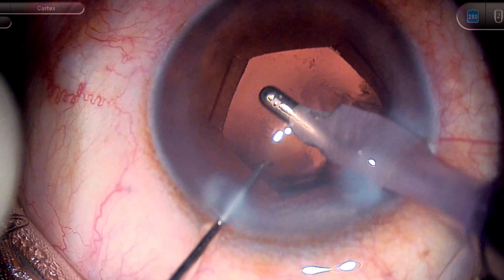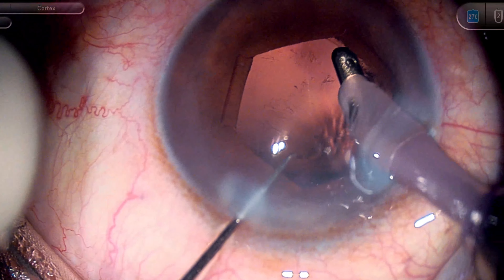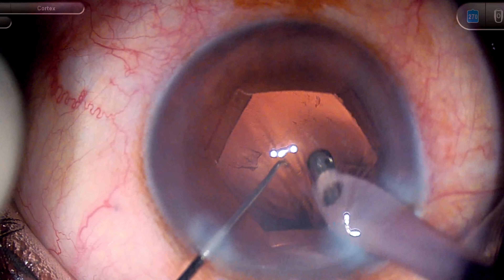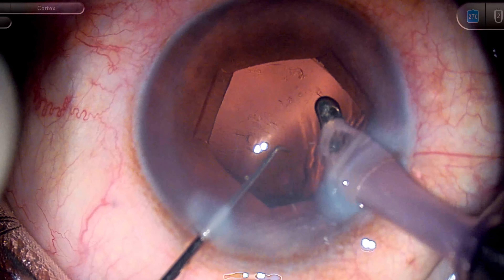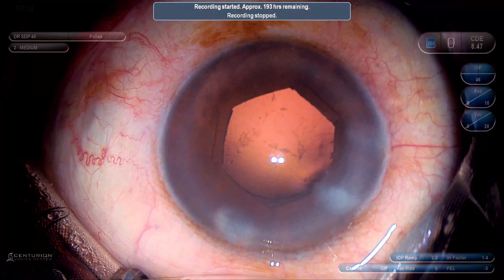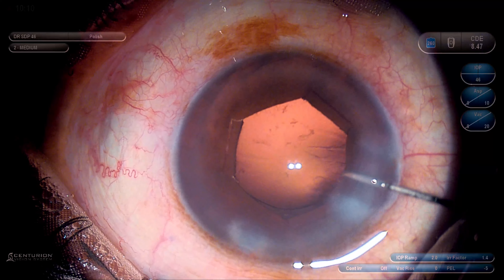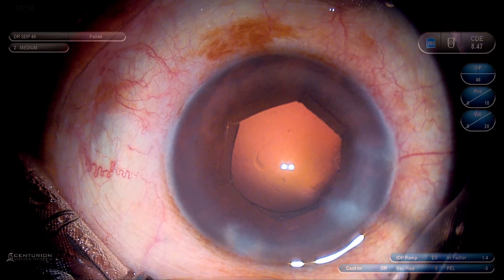Using bimanual IA is also a good idea. I am used to coaxial IA, but if you are used to bimanual IA you can use that. Important is to maintain the anterior chamber during cortex aspiration. The small cortical fibers on the posterior capsule can be easily hydro-polished — just direct a jet of fluid towards those cortical fibers. During hydro-polish, make sure you don't inject suddenly into the sulcus as that may cause fluid misdirection.